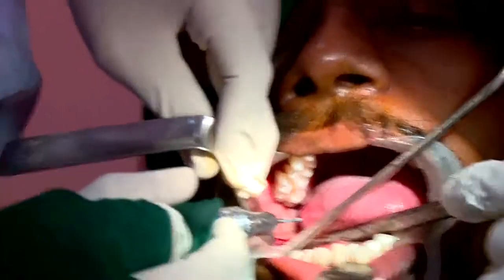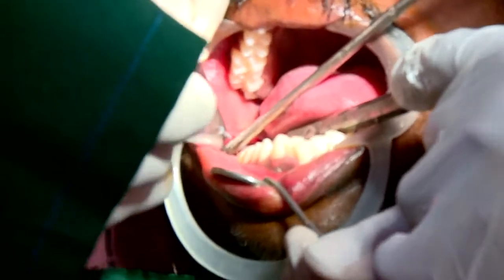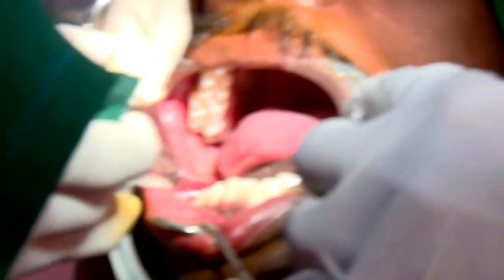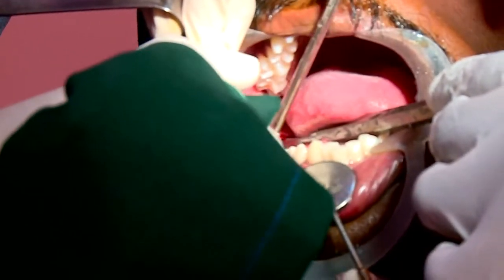Yes sir, the bone guttering has been done. The adequate amount of bone has been removed on the buccal side and the distal side. And the next procedure is, since you can see that the bleeding is from the medullary part. Don't shake the camera. Yeah, that is the limitation.